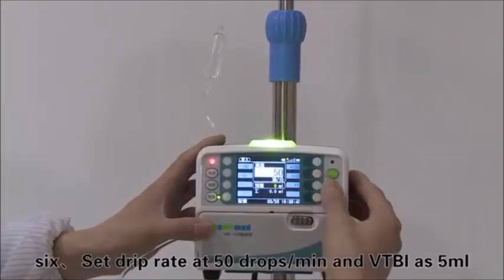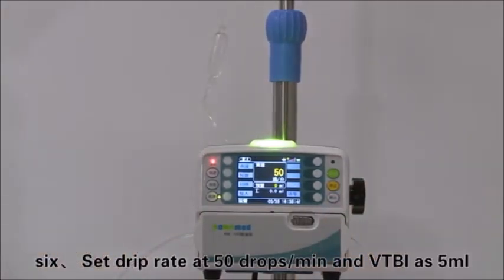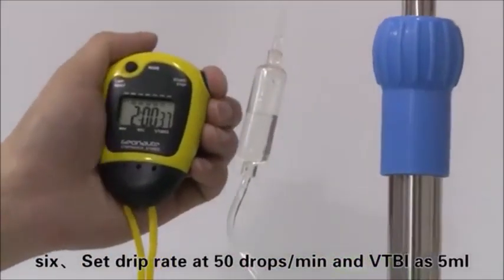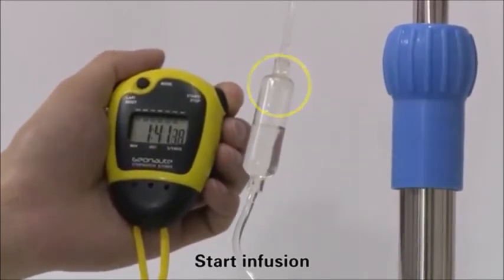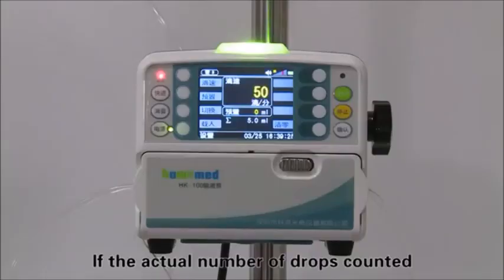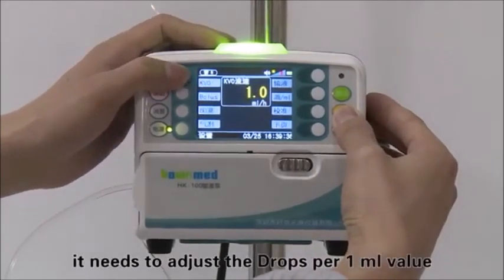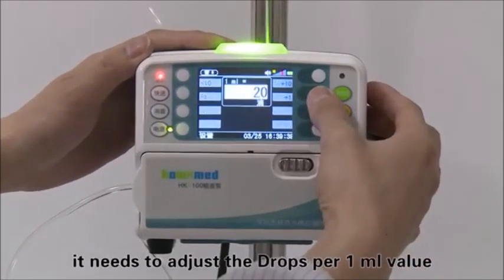Set the drip rate at 50 drops per minute with VTBI at 5 milliliters, then start infusion. Check the actual number of drops within the 5 milliliters. If the actual drop count differs too much from the preset value, adjust the drops per 1 milliliter value accordingly.